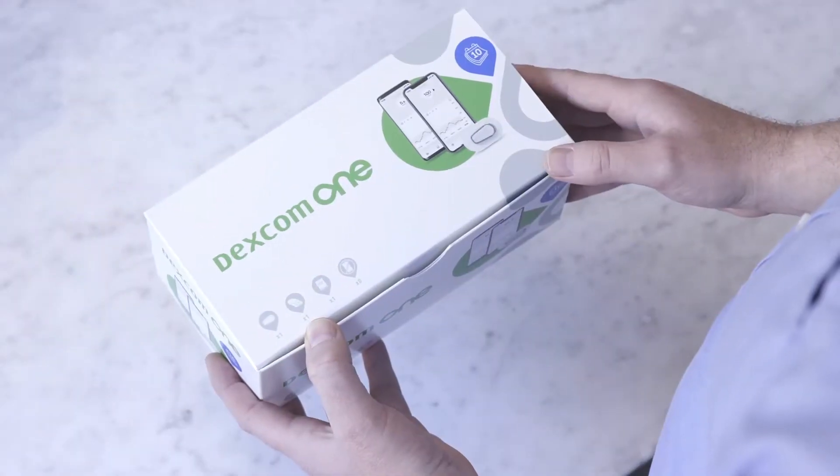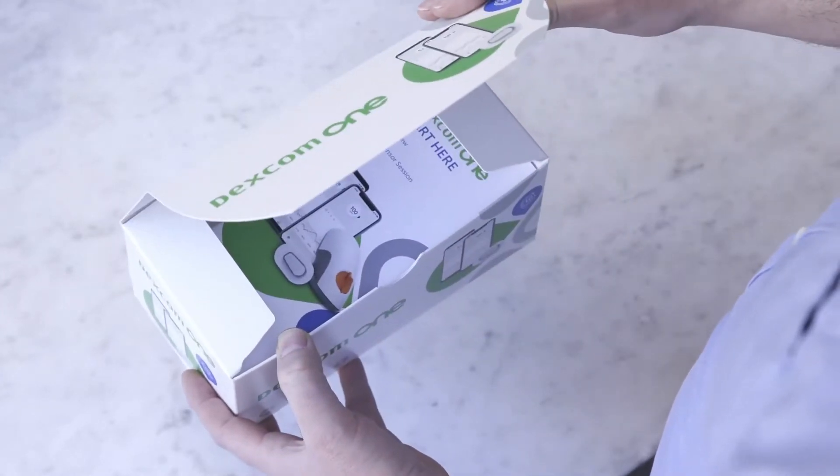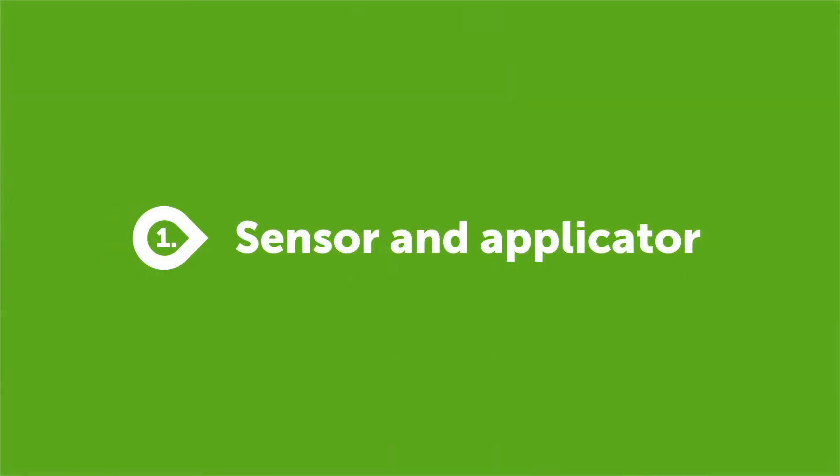Dexcom One is a continuous glucose monitoring tool for managing diabetes and we are going to show you how straightforward it is to get started. First, let's look at the three components that make up the Dexcom One.